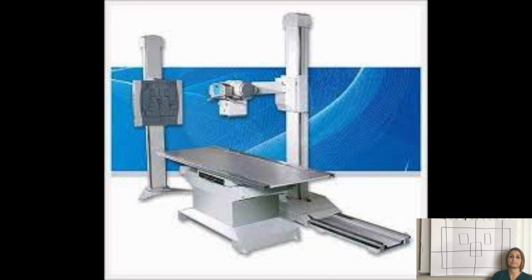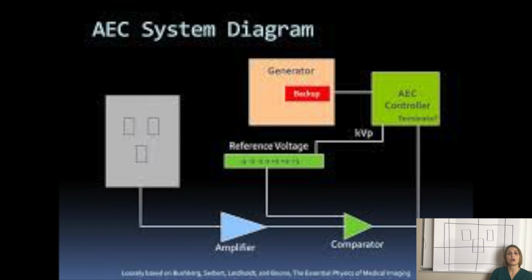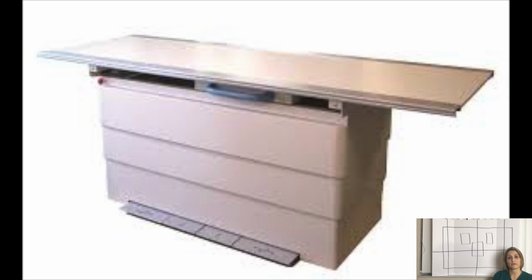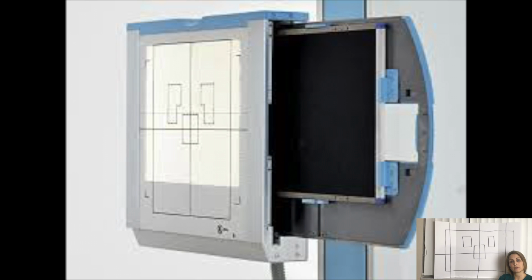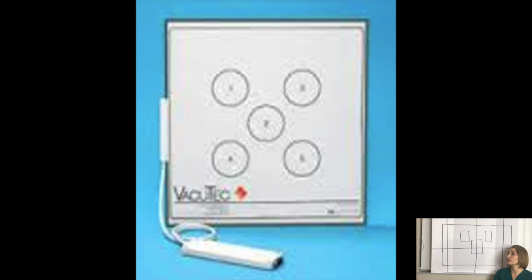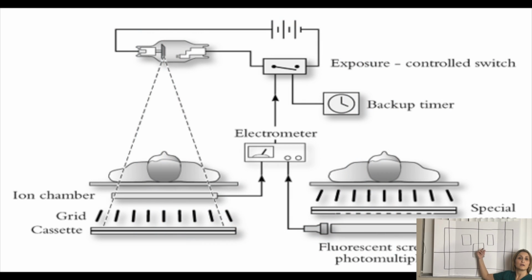The most important element when using an AEC device is the position of the exact body part above the ionization chamber. That is why the most important part of using AEC devices is how the radiographer positions the patient. The most common combination used by radiographers is with the center chamber at the center of the IR. This will place the chamber below the duodenum and transverse colon for the majority of the abdominal examinations, eliminating gastric and bowel gas being placed over the chamber.